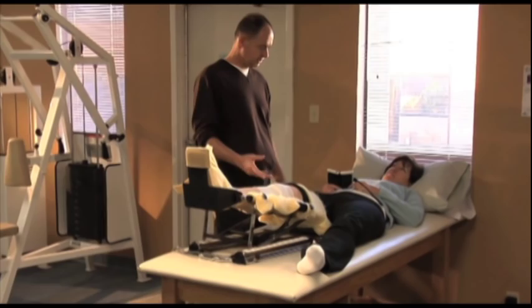Studies have shown, and it has been the MedCom group's experience, that when the CPM machine is applied and the swelling is reduced, the patient's need for pain medication is also reduced.